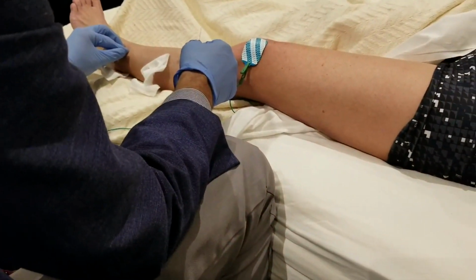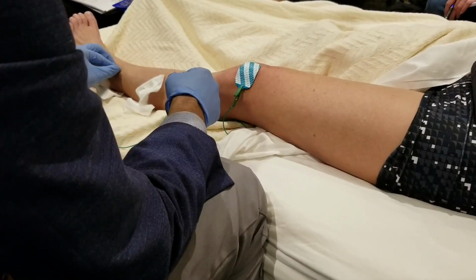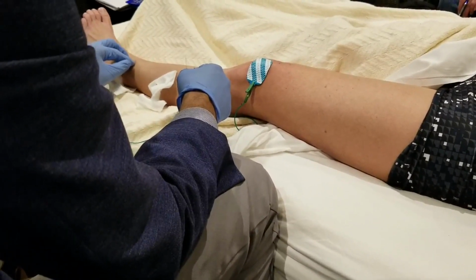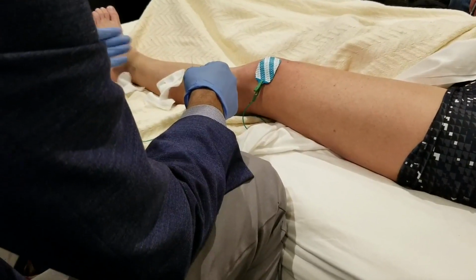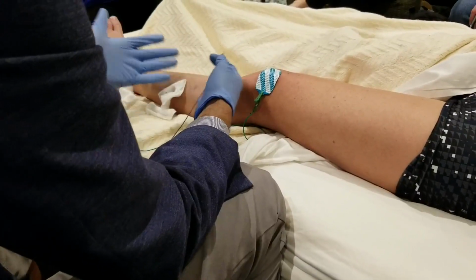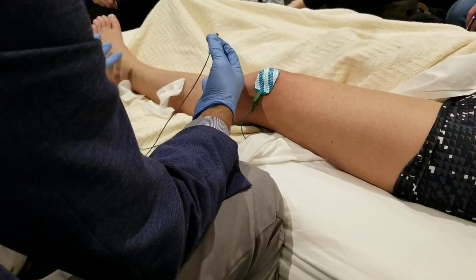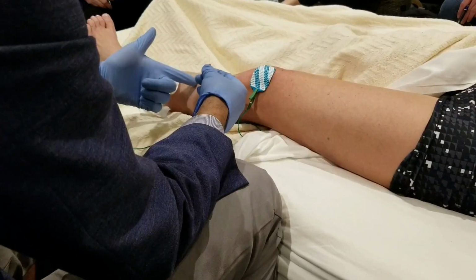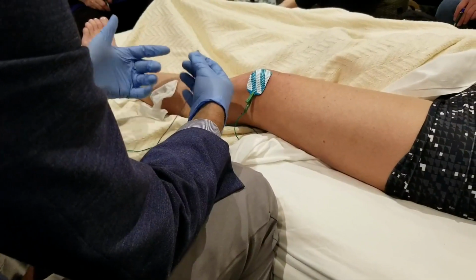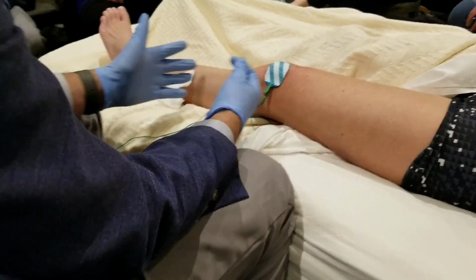This peroneus tertius is innervated by the deep peroneal, deep fibular nerve, L5 predominantly, some S1. I like this muscle because for studying peripheral neuropathy, it's a more distal muscle than the tibialis anterior. Sometimes in mild peripheral neuropathies, the sensory conduction studies may not be that affected, maybe a little affected, and the tibialis anterior and medial is not too involved. So it's a good muscle to show that there's some length dependency in your exam.